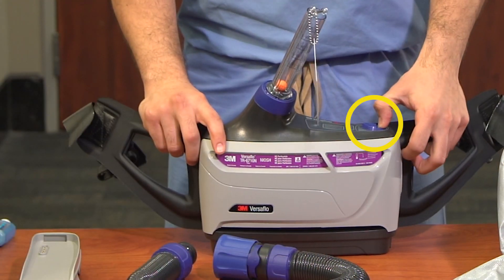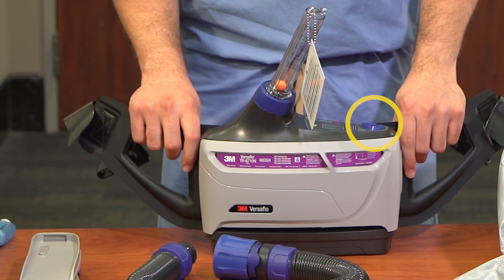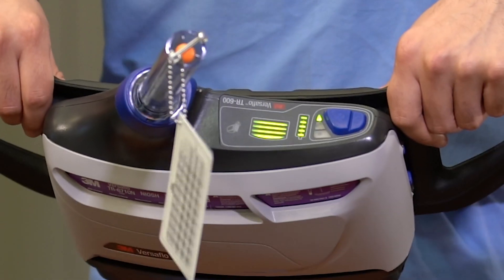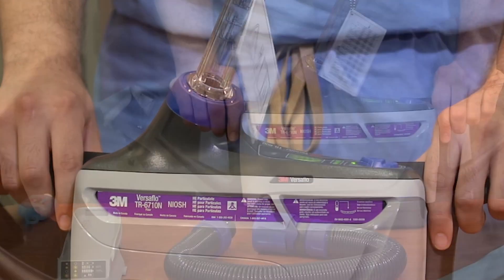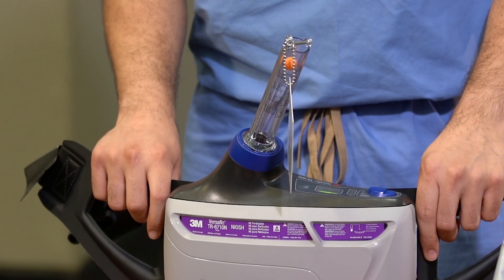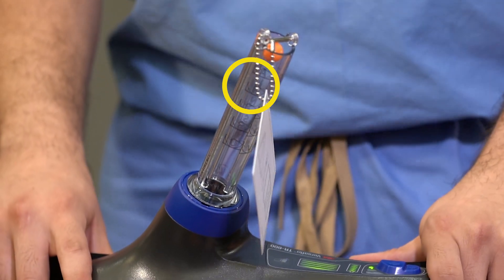Depress the blue on-off button located at the top of the device until the fan motor is engaged. The device will proceed through a start-up phase — it will beep and vibrate, and will also display the battery charge level. Ensure the battery is fully charged. Ensure that the device is set to the lowest airflow setting. Watch the orange ball in the airflow meter and ensure that it floats at or above the F mark on the meter.